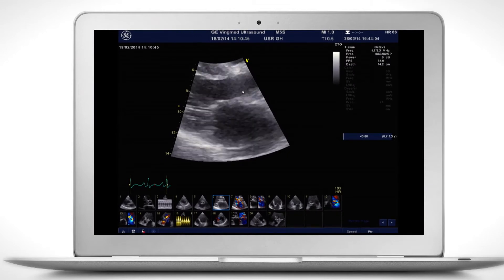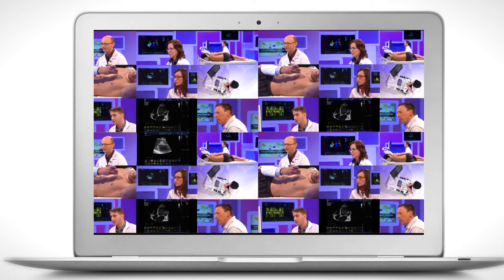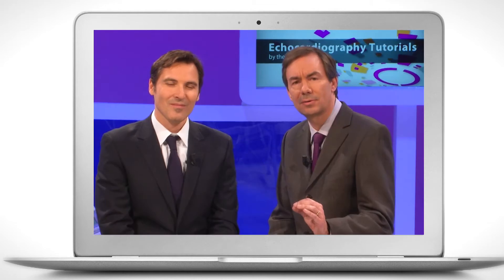And then look at this abnormal mass moving. A practical approach to echocardiography in clinical daily practice.